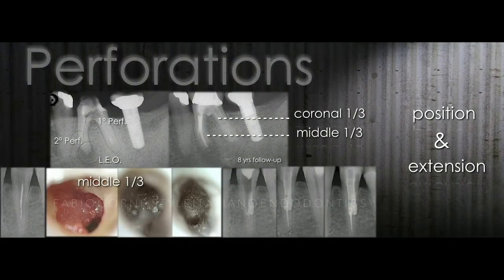In this case, for example, we can see two different situations. In the molar, we have two different problems. One perforation is located on the pulpal floor, the other one in the middle third, plus a lesion of endodontic origin. The follow-up shows a perfect healing of both problems, but the difficulty of reaching the middle third, like in the bicuspid in the lower arch, is completely different.